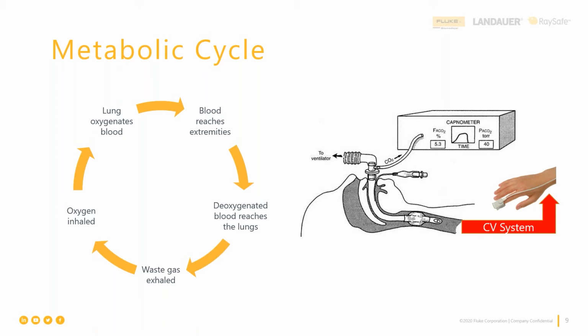Well, the cool thing about all of this is we're talking about non-invasive measurements that can give us a really good picture of what's going on that are not able to be identified or understood by the five senses, okay? What I can see, what I can hear, what I can smell, what I can taste, and what I can feel. You can't get that understanding of this gas exchange with the five senses. So it's technology that is really enhancing or really giving more than just that five senses assessment of patient health. And that's just so important.